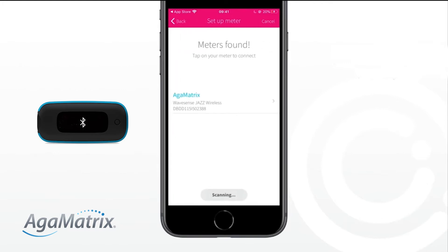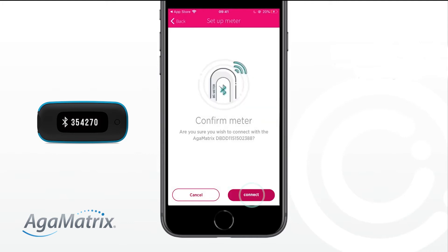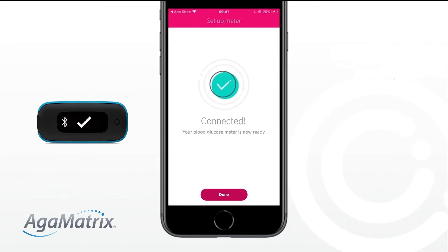Once the Meter Found message is displayed, tap on AgaMatrix and when prompted, enter the 6-digit code displayed on your meter into the app. Finally, confirm you wish to connect the meter by selecting Connect. You are now connected.